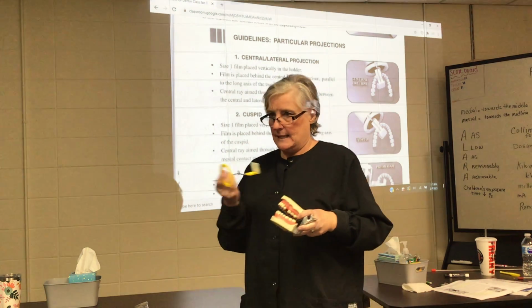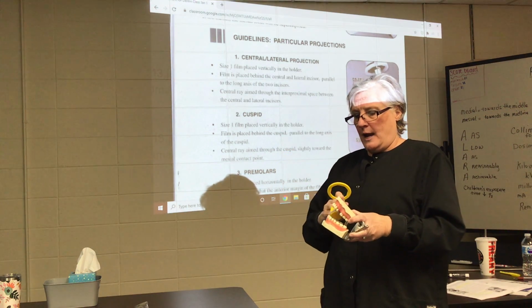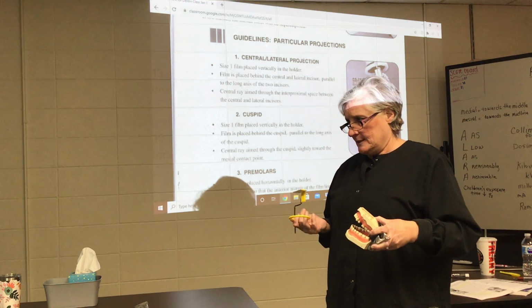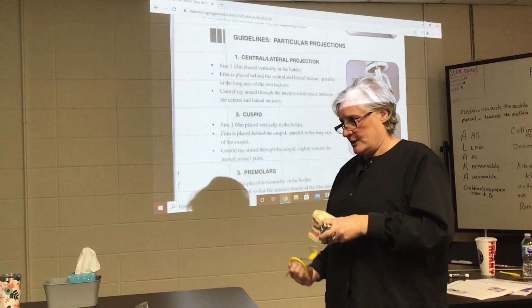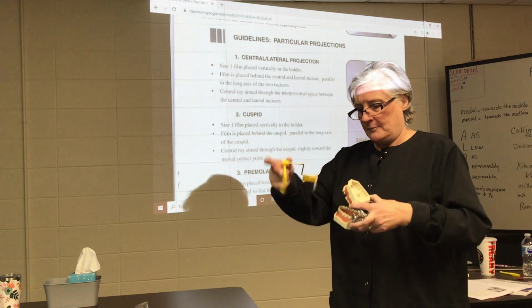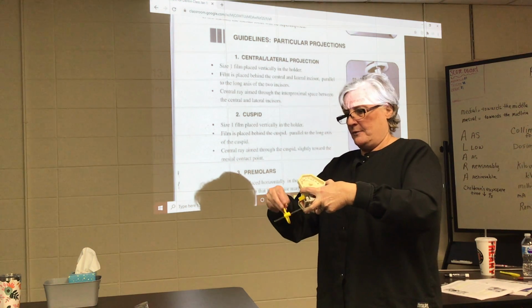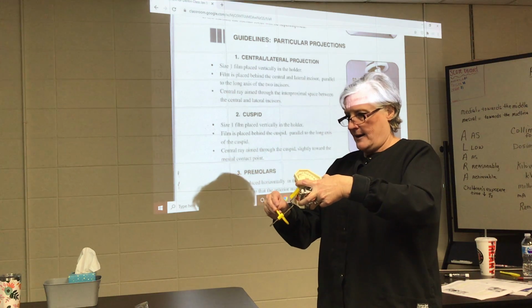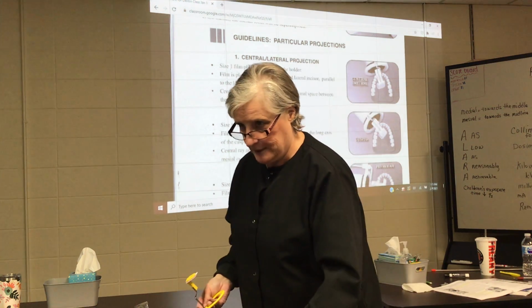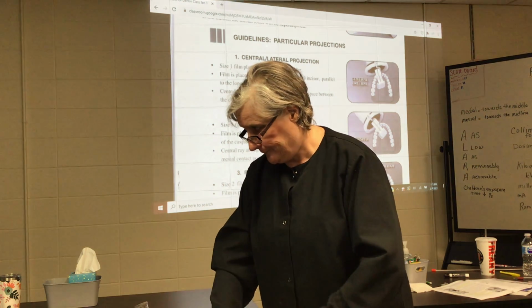Now, this instrument is set up, it works like an X. So, the upper right and the lower left, it's positioned in the same direction. So rather than change it, and then get to the other side and change it again, I'm only gonna change it one time. So I'm gonna take the premolar and the molar on the upper right, I'm gonna switch over to the lower left and do the molar, and then the premolar, using the distal of the canine as my guide. Now I'm going to switch it, after I've taken a molar and a premolar, and a molar and a premolar.